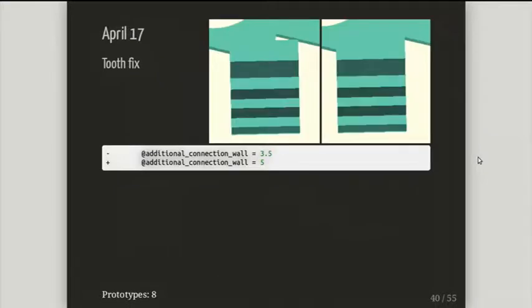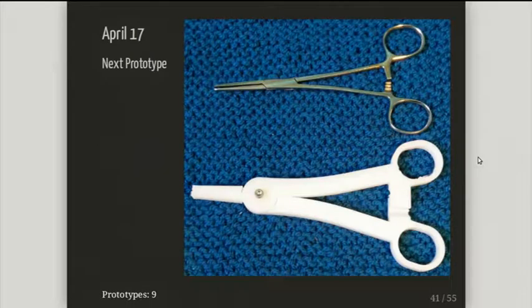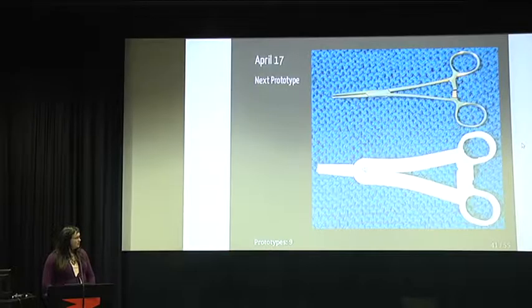What do I do? Make it bigger! I just made it a bit bigger, which required a small hack, and that was number nine. I had a working hinge, a working tool head, a good looking arm mechanism, and a somewhat working grip.